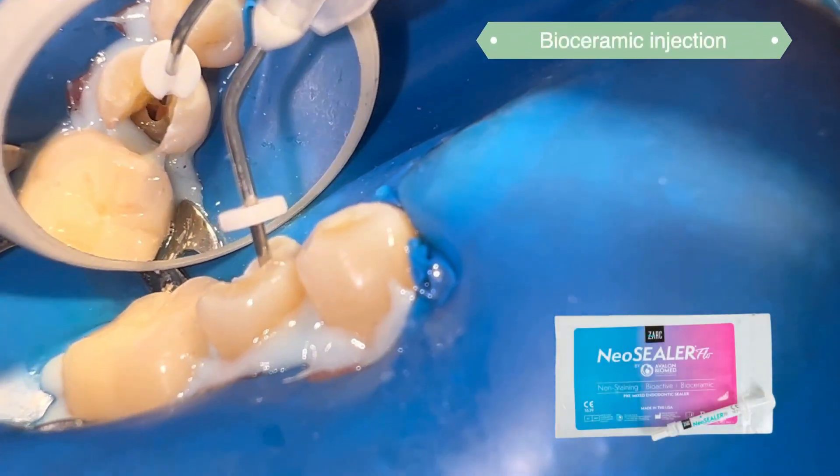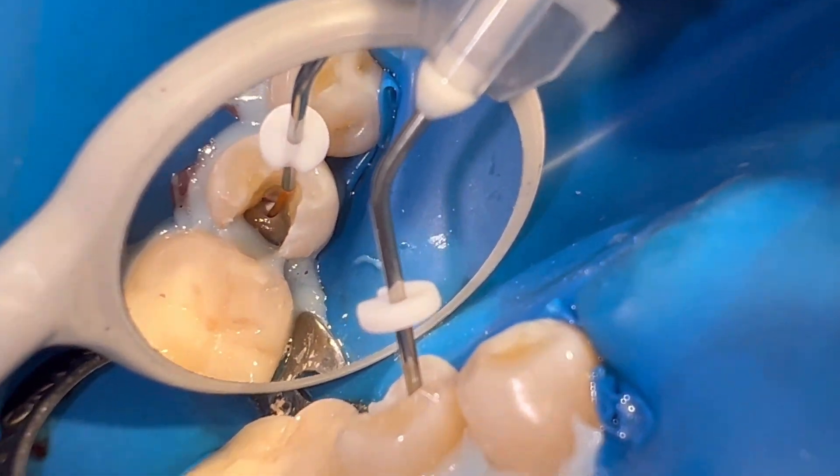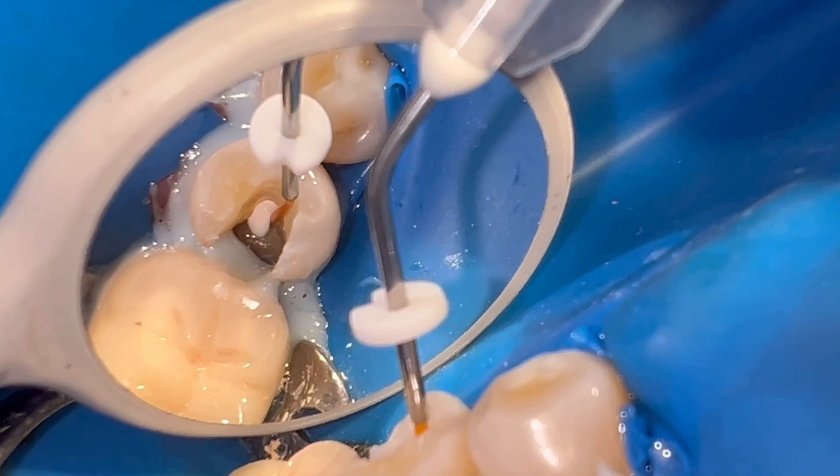We apply the cement directly in the middle third of the canal. In this case I use a bioceramic cement from the Zark brand.